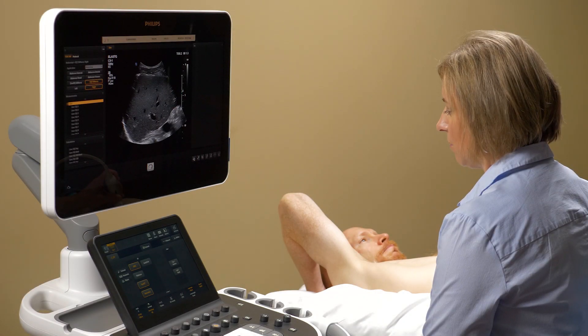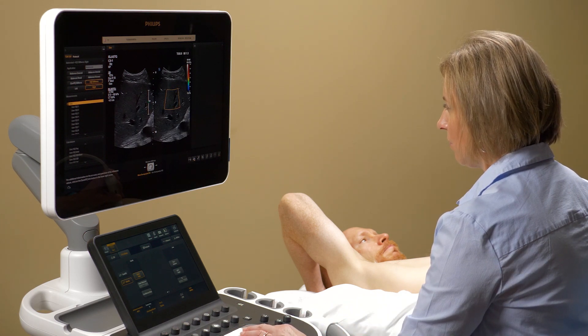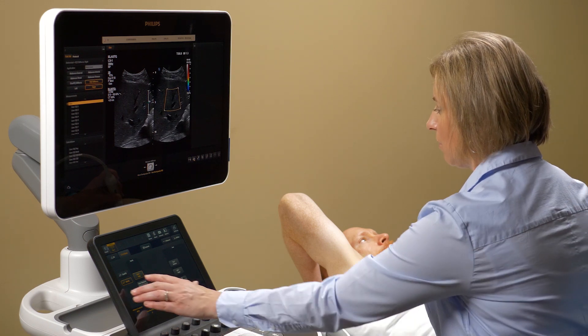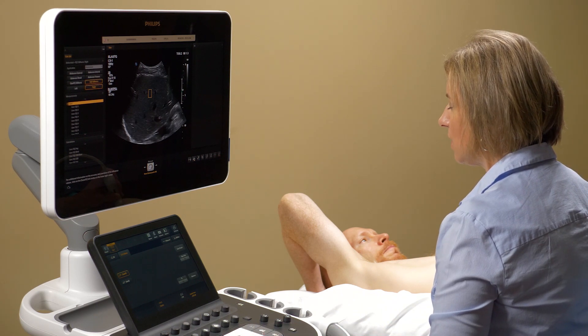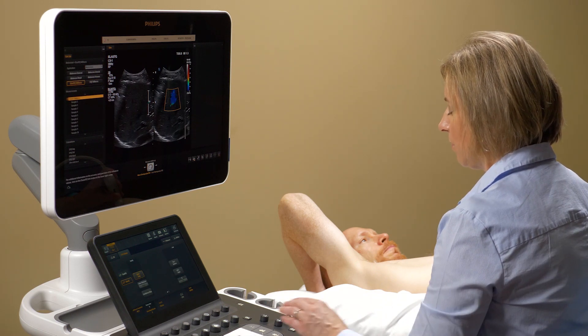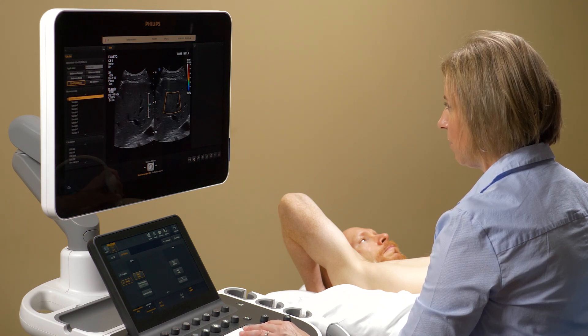Philips EQI is a shear wave-based technique which provides real-time feedback, confidence in quantification, and speed to advance the use of elastography in clinical practice. Philips has developed two shear wave techniques: ElastPQ and ElastQ Imaging. ElastPQ has proven valuable in staging liver disease and reducing the need for costly and painful biopsies in some patients. ElastQ Imaging advances shear wave elastography, providing a technique that is not only non-invasive and easy to use, but also offers clinicians additional confidence in the reliability of measurements.